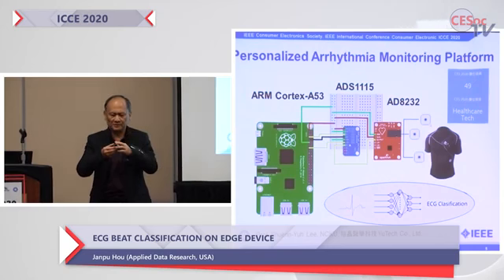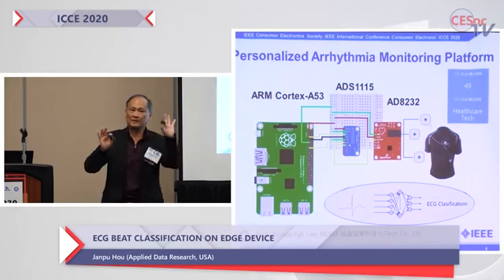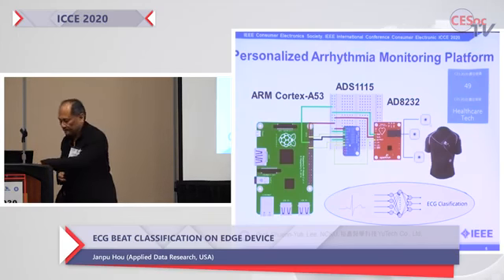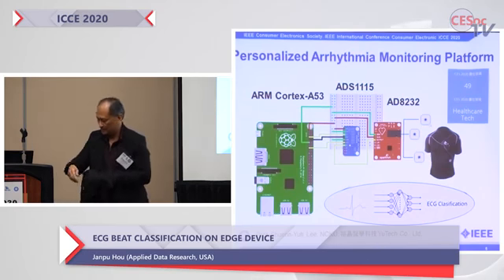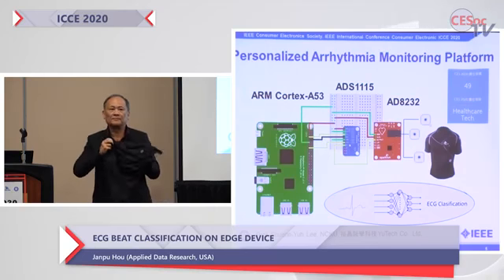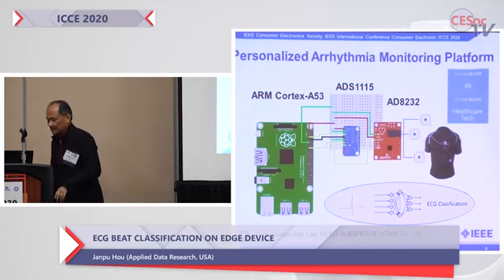The device itself is actually small. What's big is the battery, because the battery charge is the large part. Typically, after you charge the device, you put it on and you dress up and then start to run. Okay? But that's not what I talk about today.